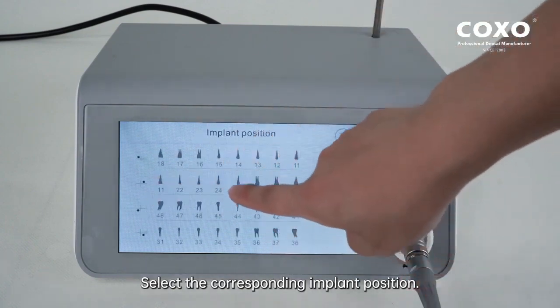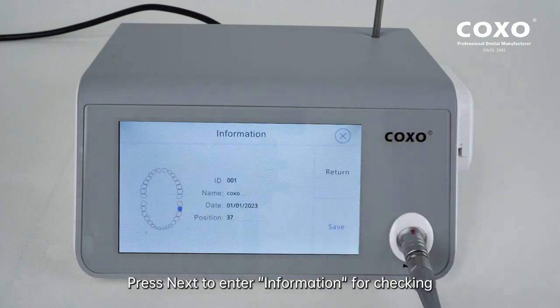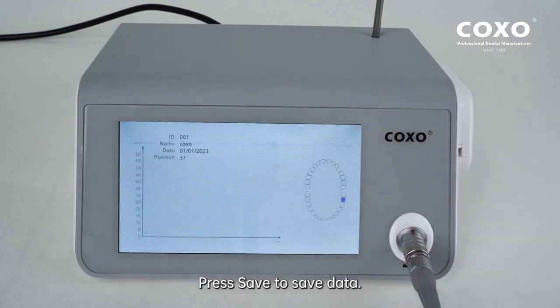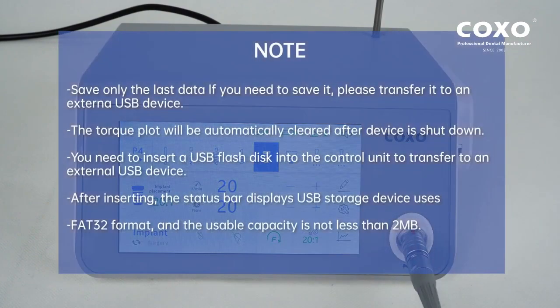Select the corresponding implant position. Press Next to enter information for checking. Note: the device saves only the last data; if you need to save it, please transfer it to an external USB device. The torque plot will be automatically cleared after the device is shut down. Insert a USB flash disk into the control unit to transfer to an external USB device. After inserting, the status bar displays USB storage device.